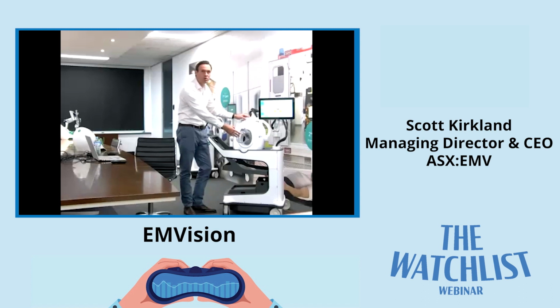And what it will do is output an example image from one of our earlier studies that we published out of the Princess Alexandra Hospital. That was an early successful proof of concept study with 50 confirmed strokes. So that's the length of the scan cycle. From moving it to the bedside, doing the whole workflow, performing the scan, we're targeting under 10 minutes at a minimum.